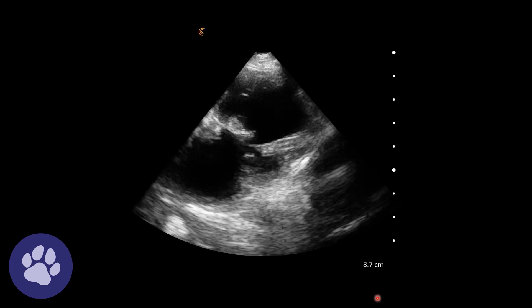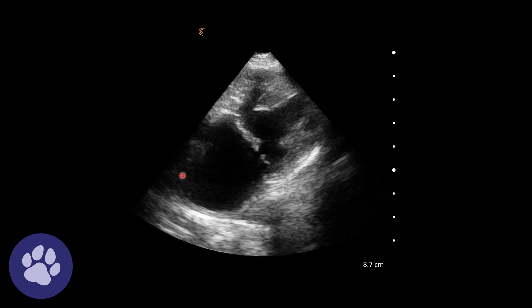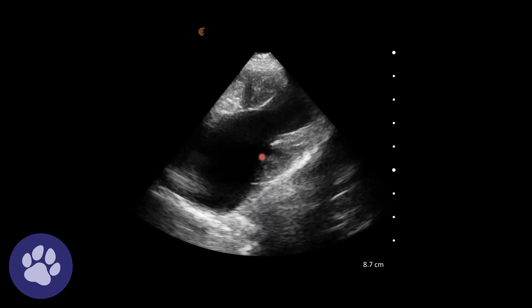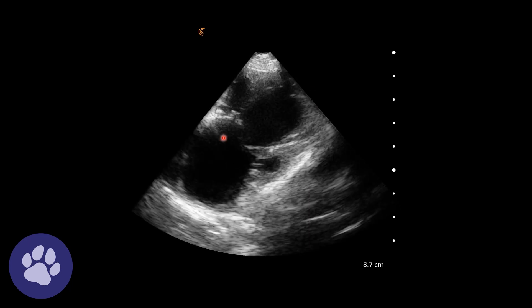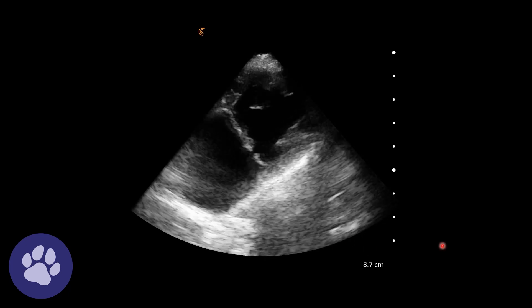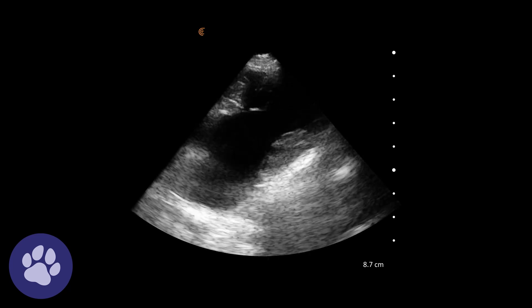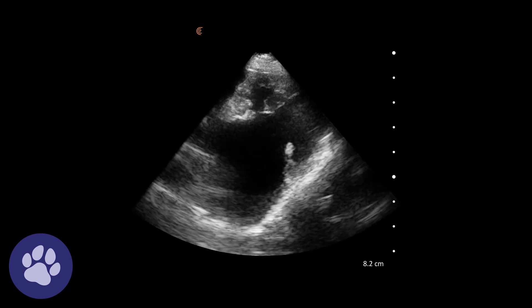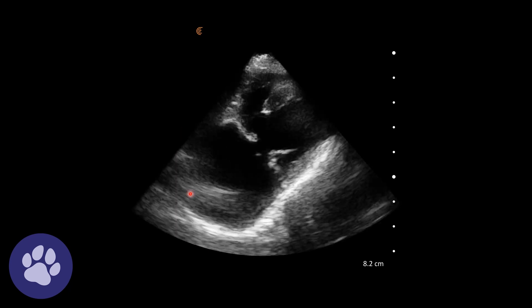Now we have some left-sided views of the heart. We have the left atrium here, the mitral valves opening and closing here, and the left ventricle here. The mitral valves are a bit more prominent than normal — they're thicker than normal — suggesting mitral valve disease is the cause here. And at this angle we can clearly see the left atrium is very enlarged.